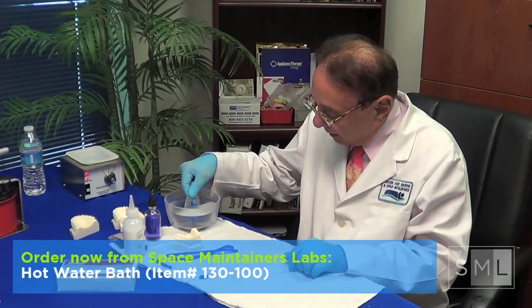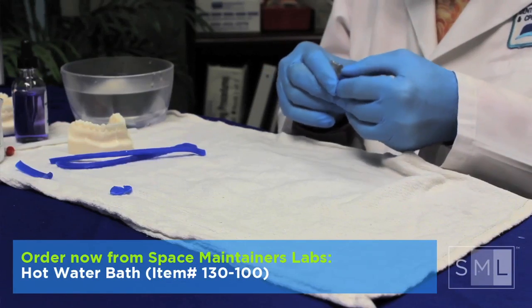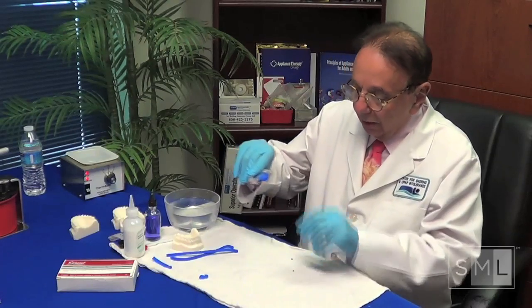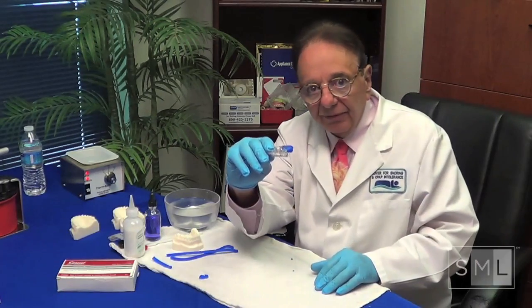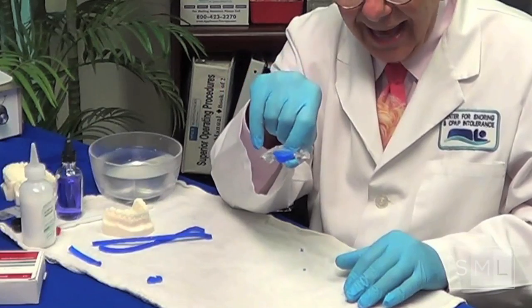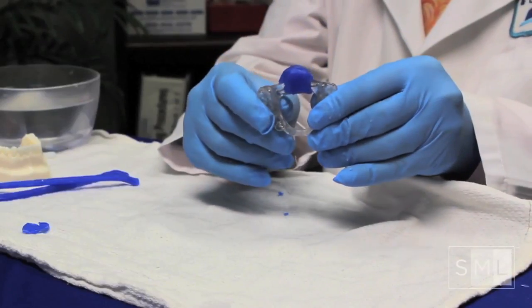I like to put it in hot water — it just makes the wax easier to work with. Now I'm going to spread it out. Let's look at it from the side, from the back, and inferiorly. There it is. Now we try this in the mouth again.